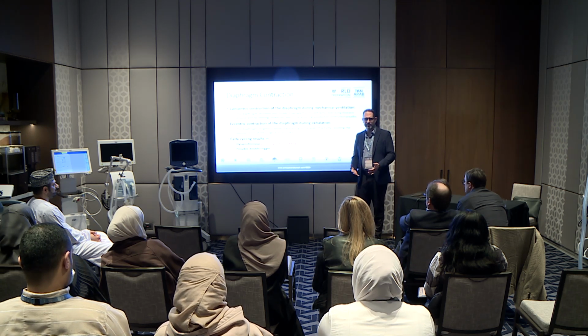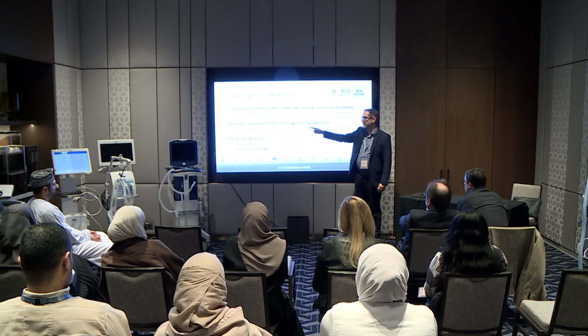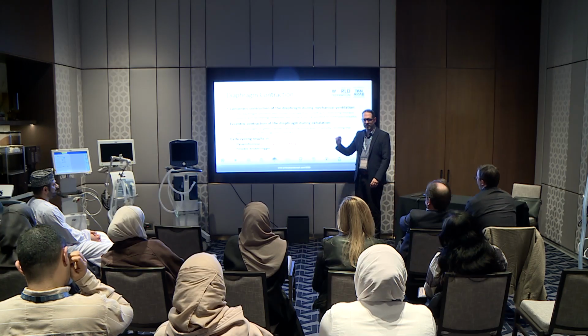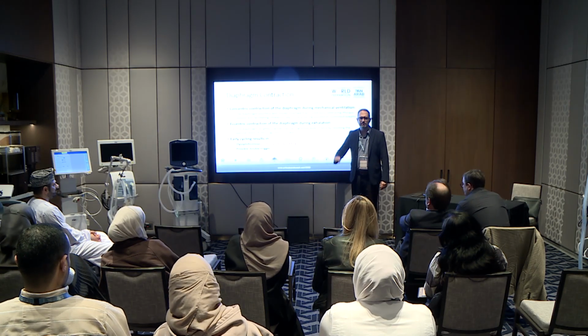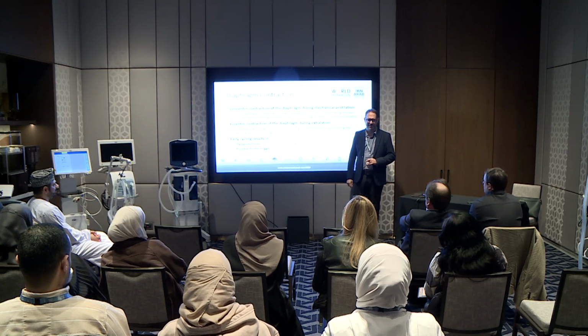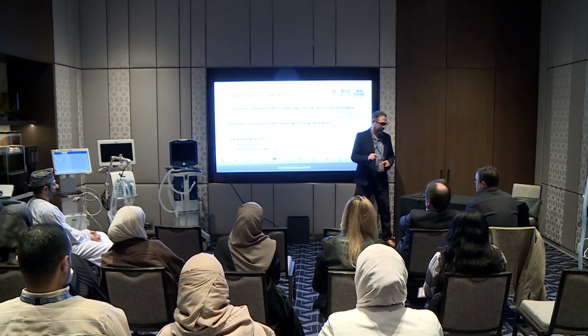If they trigger the ventilator, that's concentric contraction. But if it cycles off and they continue, then a portion of it is eccentric. Because it's kind of both, they're calling it post-inspiratory loading. This might be one of the options in one of the quiz questions, so just remember post-inspiratory loading. And then, of course, it can result in a double trigger.